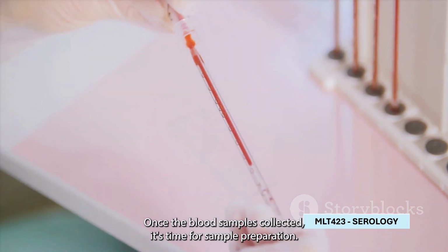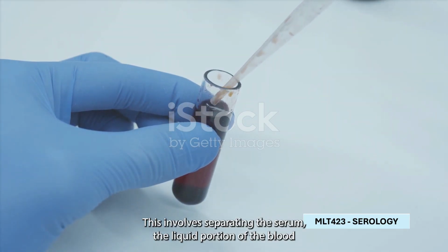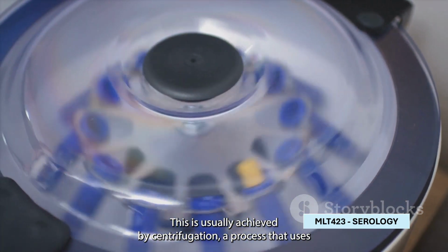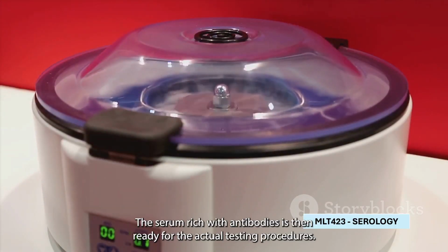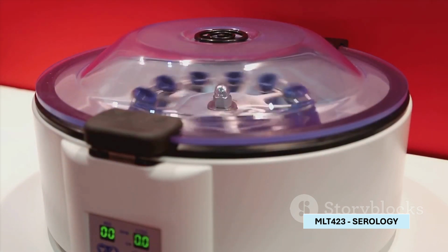Once the blood sample is collected, it's time for sample preparation. This involves separating the serum, the liquid portion of the blood, from the cells. This is usually achieved by centrifugation, a process that uses centrifugal force to separate the blood components based on their densities. The serum, rich with antibodies, is then ready for the actual testing procedures.